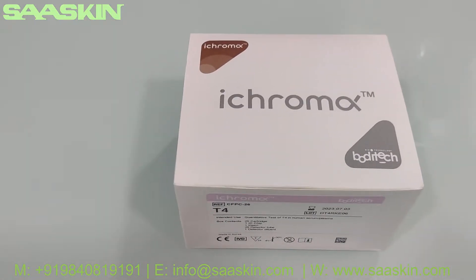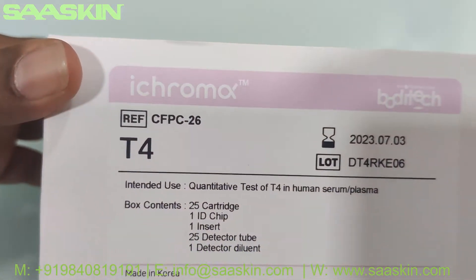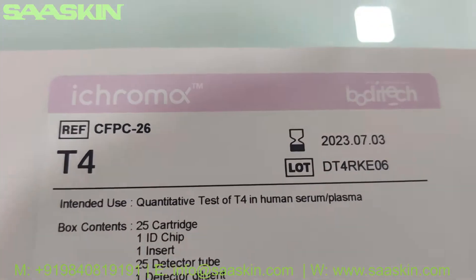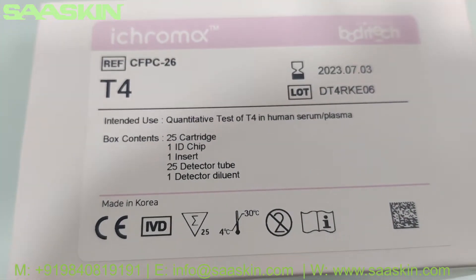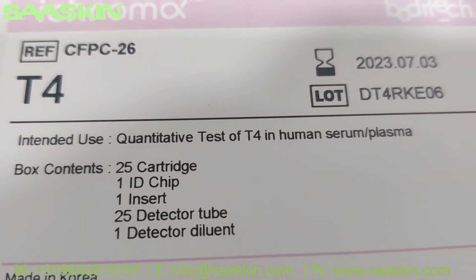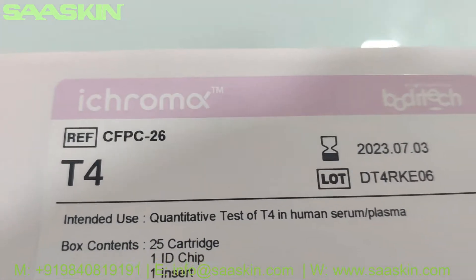Hello everybody, today we are going to see the unboxing of ichroma Boditech T4 Test Cartridges. It's from Boditech ichroma T4 — this is a CE certified kit and it's IVD certified. It is for the quantitative test of T4 in Human Serum and Plasma, and this is the reference number.